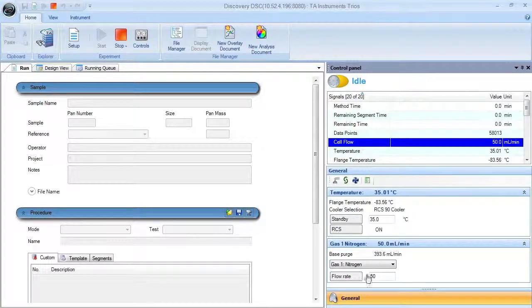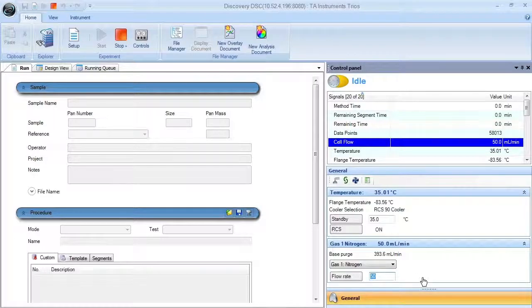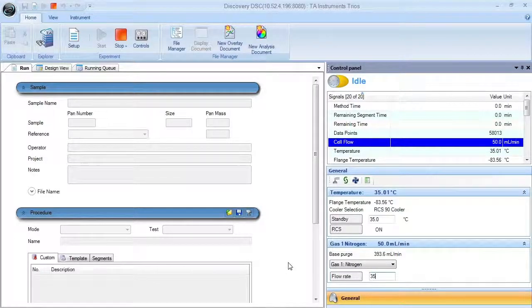To edit the flow rate, type in the flow rate value into this box and then select Flow Rate.